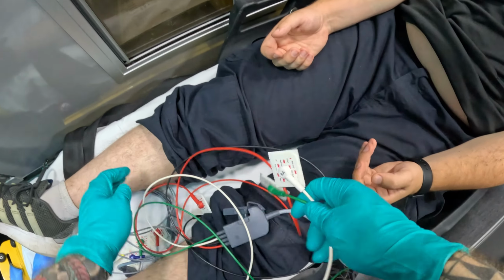And what I want to point out to you, so hold the shirt higher, is that if I draw lines, I want straight lines. I want a straight line here, a straight line here, and a straight line here. So we have three straight lines: one, two, and then three. So this is your standard configuration for the 12-lead.